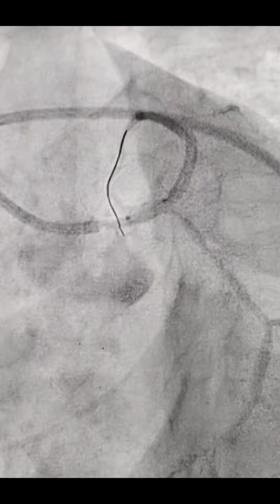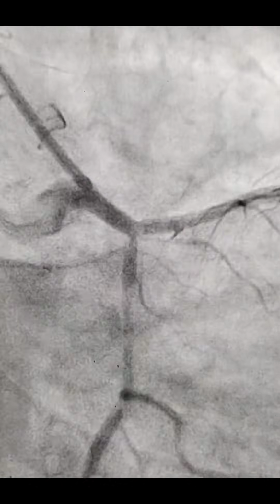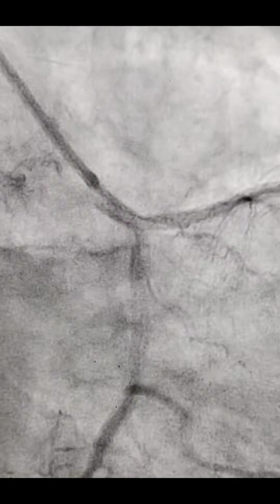And for the POT, we took a balloon of 3.5 diameter into 6 length, and this was a stent boost. And this is what we are doing, POT, proximal optimization technique. We inflated this 3.5 balloon at around 14 atmospheric pressure in the left main. During the inflation, BP fell down to 70 systolic. But after deflation of the balloon, the BP came up, and this happened after the POT.